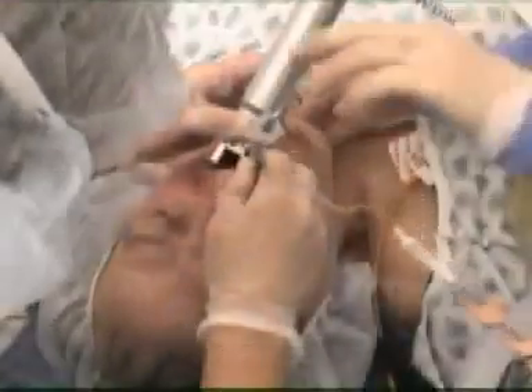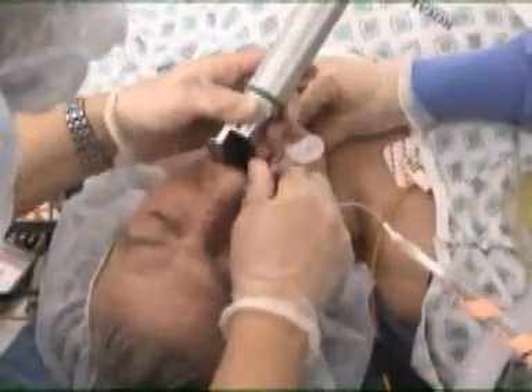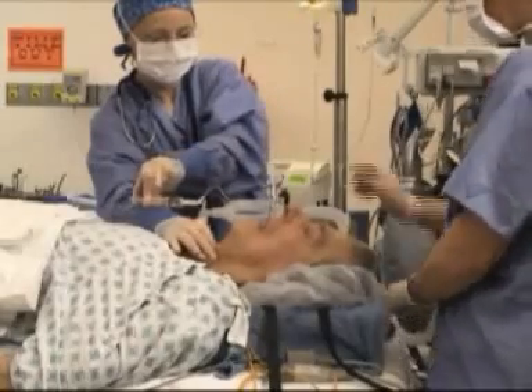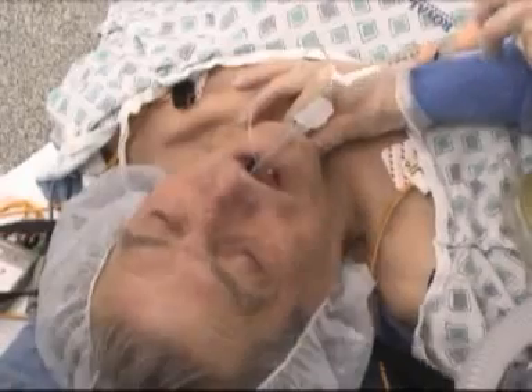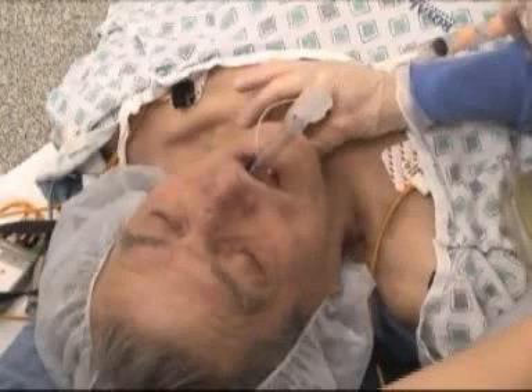Pass the tube through the vocal cords until the balloon disappears into the trachea. Remove the stylet and advance the tube until the balloon is 3-4 cm beyond the vocal cords. Inflate the endotracheal balloon with air to the minimum pressure required to prevent air leaks during tidal volume ventilation with a bag. This usually requires less than 10 cc's of air.